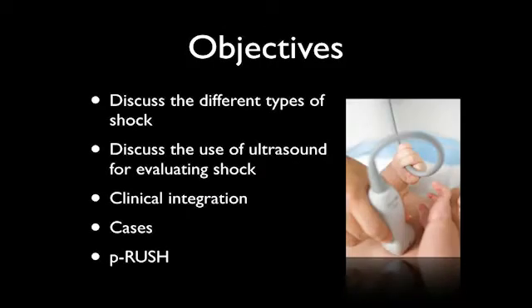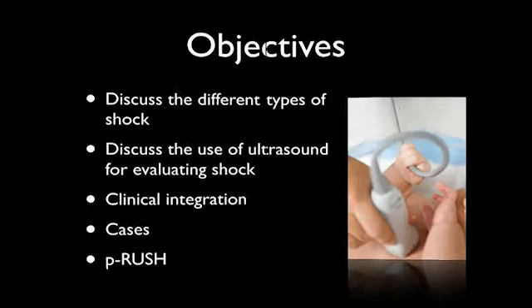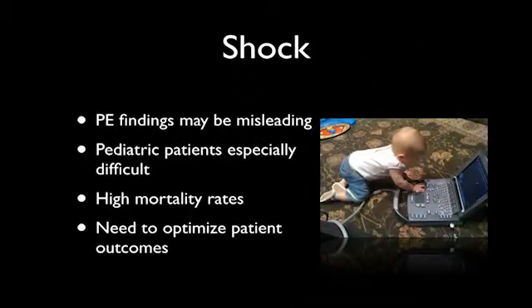So basically we'll start off by talking about the different types of shock, and then how ultrasound can actually help us distinguish which types of shock patients are coming in with. And then we'll finish with cases and what my proposal for a pediatric RUSH would be.